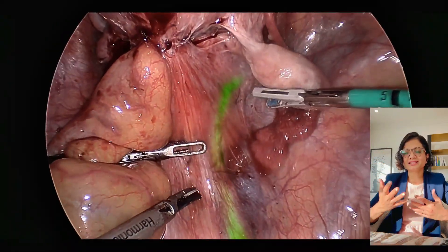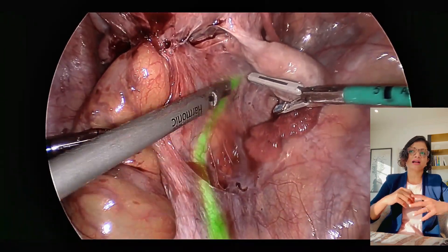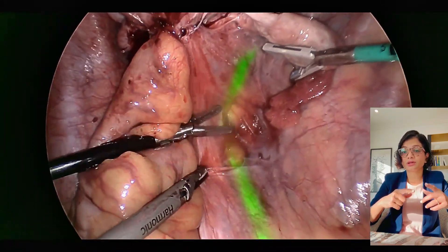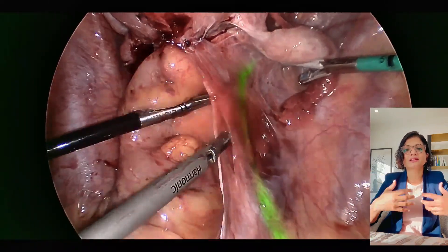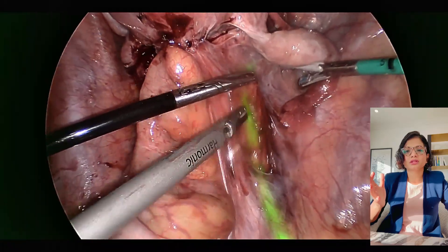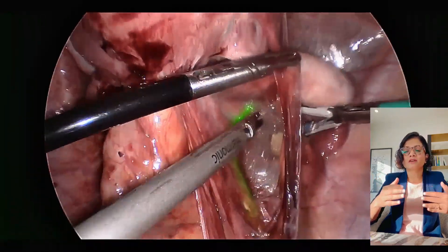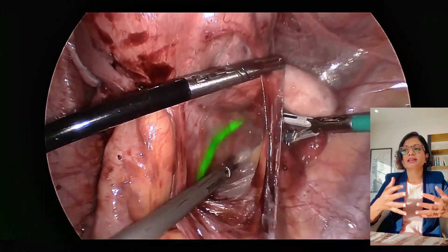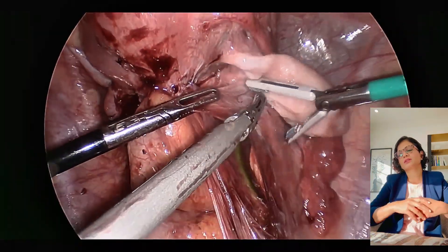This case is a bit special in that I'm actually not quite successful in doing that. You'll see how we tackle the situation. What if you can't gain really good access to the pararectal spaces? Further down when you go and you can't gain access to the rectovaginal space, what do you do? This is a video that's going to explain that.